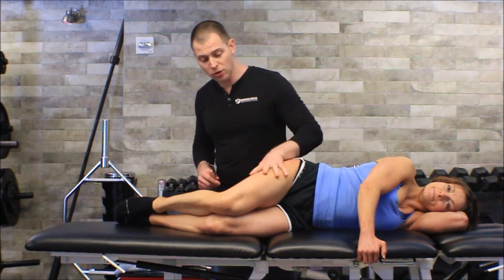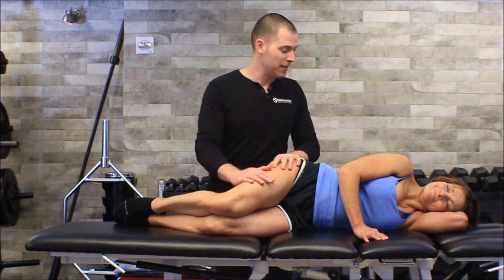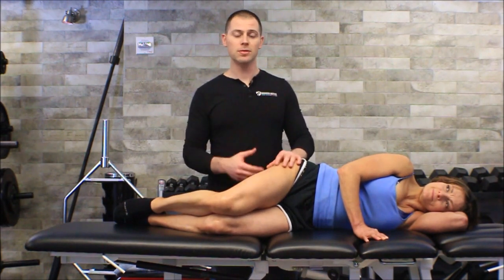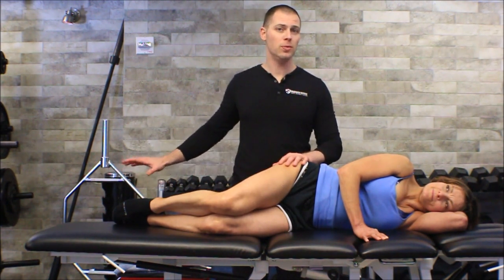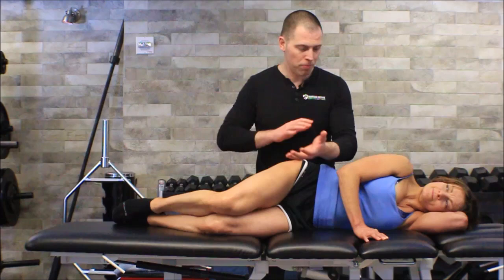All right guys, so there you have it. Go over this whole area, but when you treat this area please don't just dig into the iliotibial band — you'll give somebody a lot of petechiae, probably a lot of bruising, but probably not a lot of results. Go over the whole area, do your multiple direction strokes over areas you think are dysfunctional, attack your trigger points where you knew there were trigger points. Work with this pin and stretch with the IASTM — it's definitely one of the more powerful techniques, and probably the thing I see least often is gripping the tissue and letting movement pull those fascial layers apart.